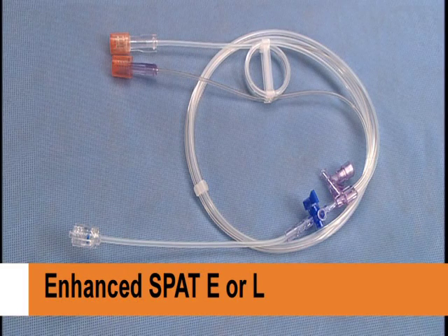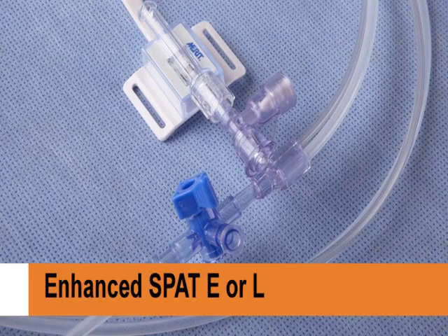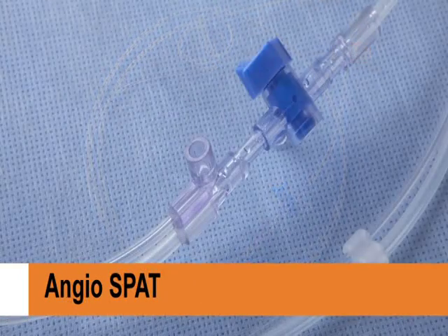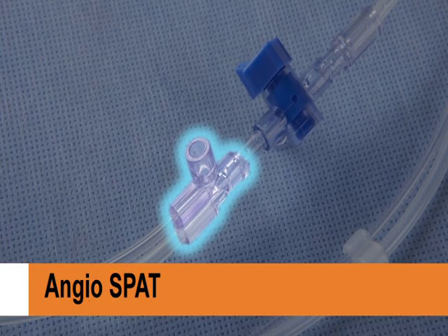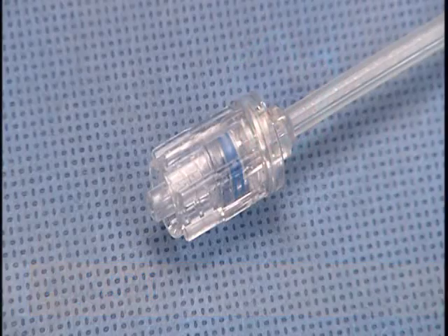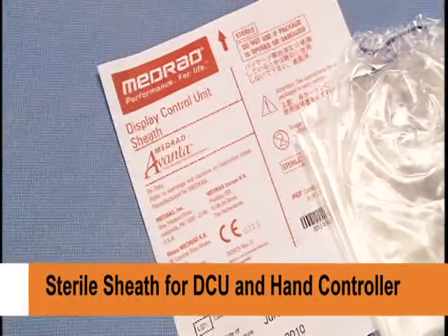Enhanced and long SPATs contain an automated pressure isolation valve assembly, or PIV, which protects the attachable transducer and aids in hemodynamic pressure monitoring for instantaneous waveform transmission. The angio SPAT does not contain a hemodynamic port and is used when a procedure does not require a transducer. The waste port stopcock can be used either as a waste port or for medication delivery. The rotating lure aids in catheter connection and manipulation.